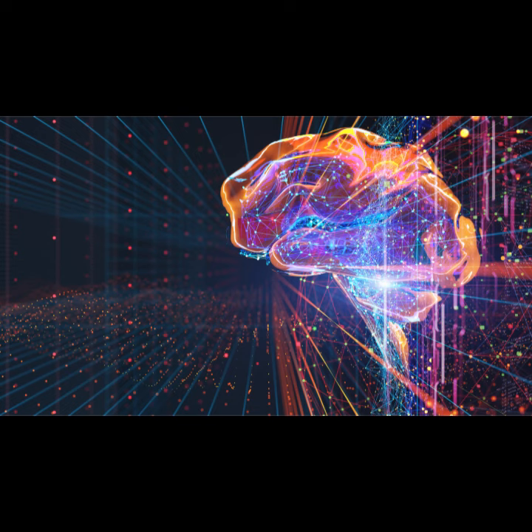How do we actually navigate this map? It all comes down to magnetic field gradients. These gradients act like the system's accelerator and steering wheel, guiding where we go in K-space. Your position and how fast you move along a path is directly tied to how strong these gradients are and for how long they're switched on.